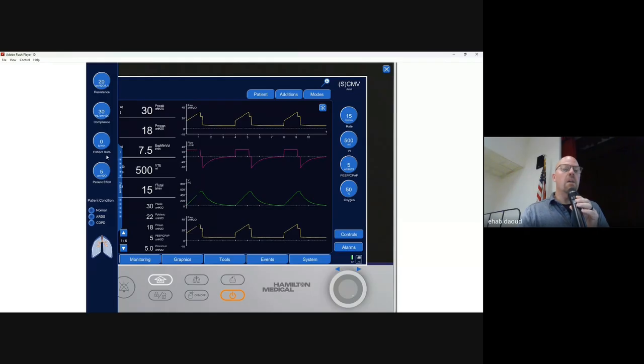Now, if you see here, what we have is two particular things that show a patient rate. That's spontaneous rate, and a patient effort. So in this situation, you have a rate set of 15. You may want to demonstrate to your new hire at the bedside, what does it look like when the patient engages in active ventilation? What does it look like when their muscle pressure changes?